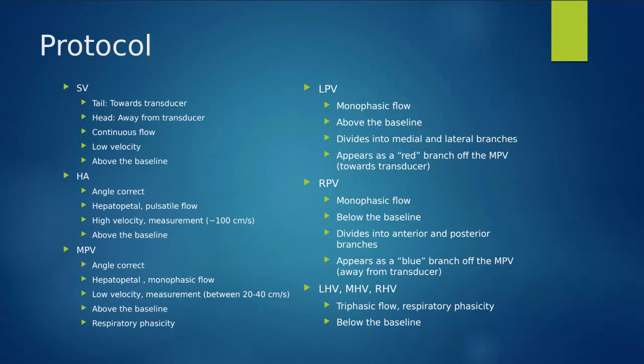Next, we have our left portal vein. So we have our main portal vein coming in here. We can see our right portal vein right there, that little blue branch coming off. And then we have this left portal vein right here. Now, our picture on the left side, a little bit zoomed in, a little bit better of an image, we see that filling in, but if we look really closely, it starts to really not fill in that much, kind of like right over here, right? And that's because this is all going to be that remnant of that left portal vein.